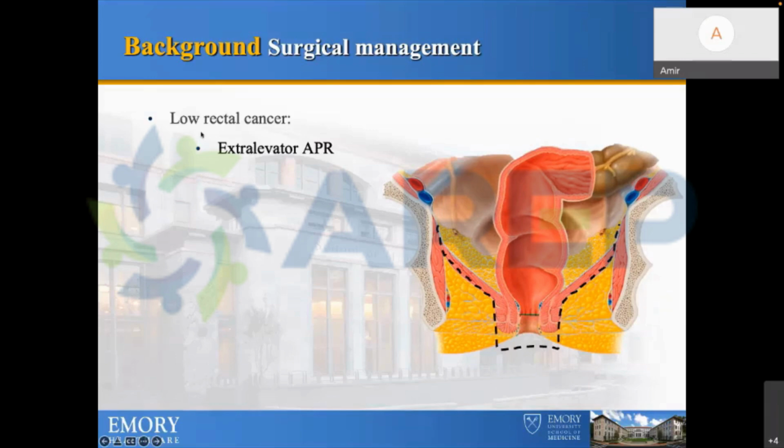For the low rectal tumors, meaning that there is a higher chance of involvement of the internal sphincter or external sphincteric musculature, or the levator muscle, they're going to take out the entire thing, and the patient is not going to be continent. Basically, they're just going to lose the sphincteric function. And again, you're going to see the resection margin involves all the muscles.